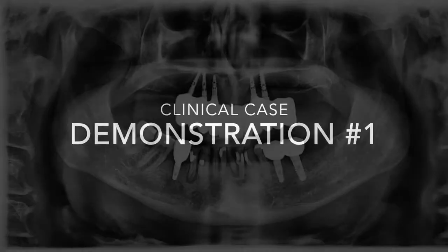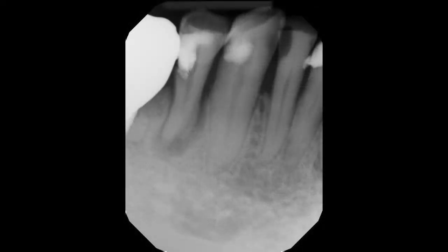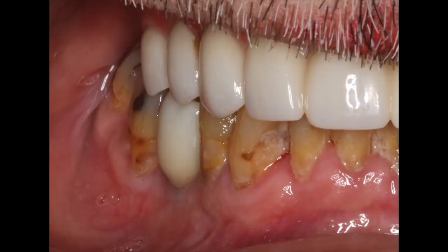We have a patient that presents with non-restorable mandibular anterior teeth that we deemed to be extracted. We want to do an atraumatic extraction and graft the site in preparation for future dental implants. There are many different ways of grafting — we can use an allograft from another human — but here we're going to demonstrate the use of an autogenous graft using the patient's own teeth, the patient's own root structure.